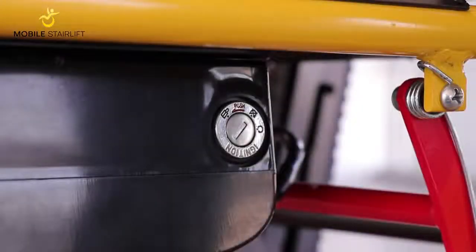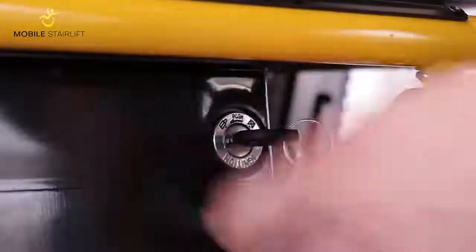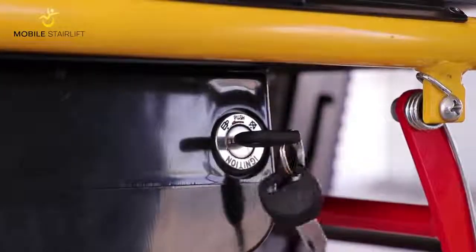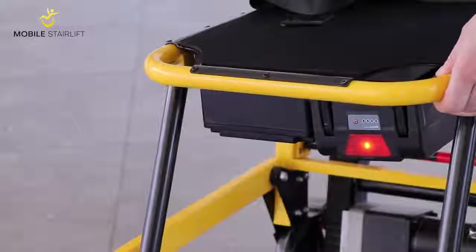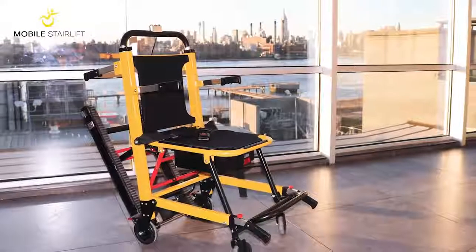Once the battery is fully charged, insert the key on the side of the battery and turn it clockwise to the red circular symbol to power on the battery. The red indicator light will illuminate when the battery is powered on. The stair lift is now ready to use.